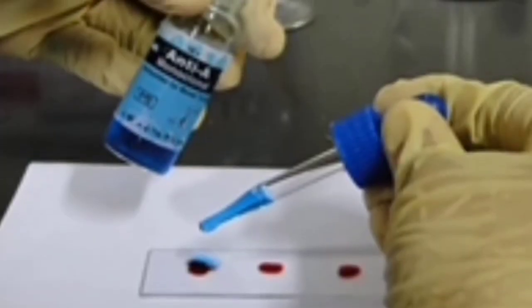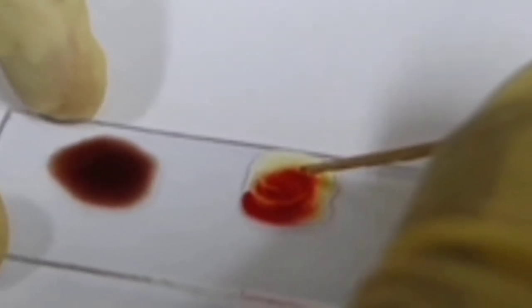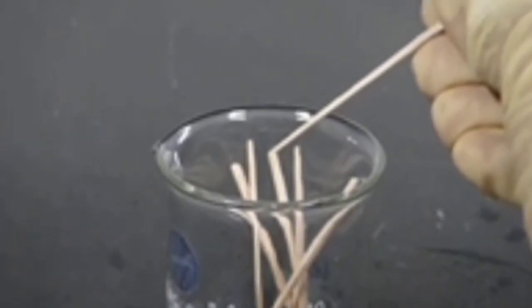Pour 1 drop each of anti-A, anti-B, and monoclonal D on each drop of blood respectively. Mix the monoclonal antibodies with the blood sample properly using a toothpick. Make sure you take a new toothpick for mixing each drop.